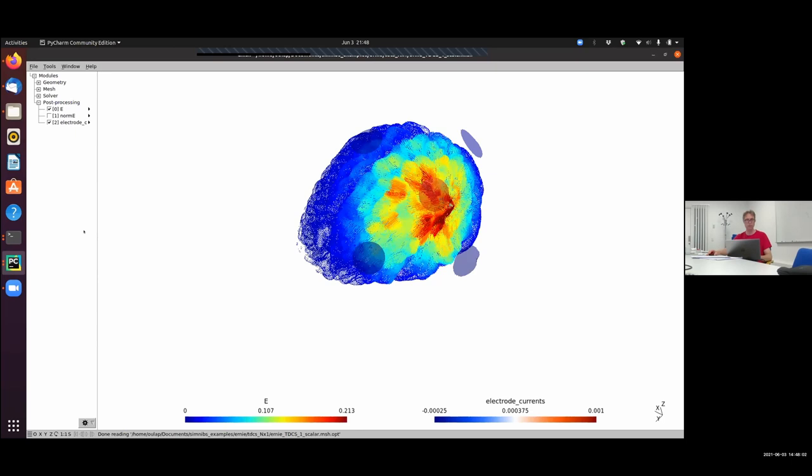Right now, after segmentation, you have to create this mesh, which is then used for simulation. This is at the moment still a little bit of a technical hassle, to go from a segmentation of your T1 and T2 and CT and so on of a non-human primate to a mesh. However, we will majorly simplify that in the next release of SimNIBS, which will come somewhere this year. I unfortunately cannot promise a date. Once this release is out, it will be very easy.